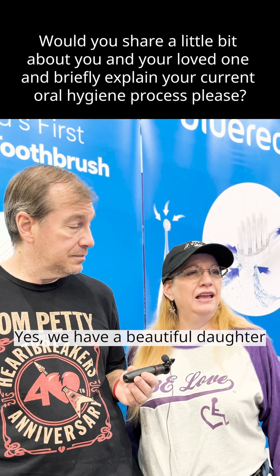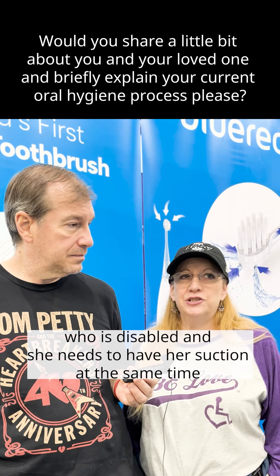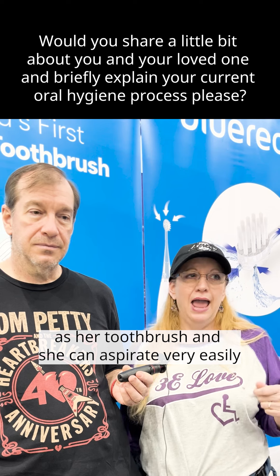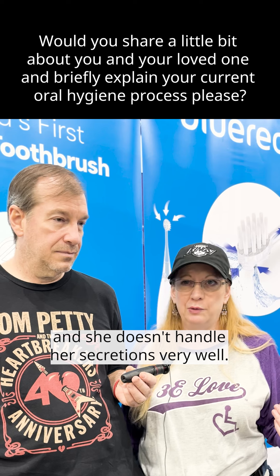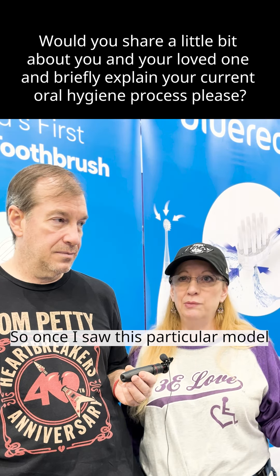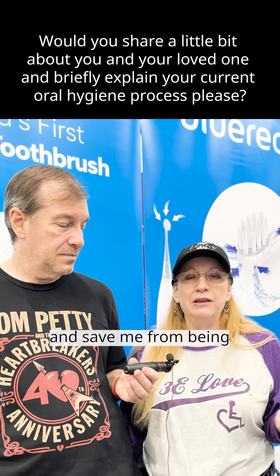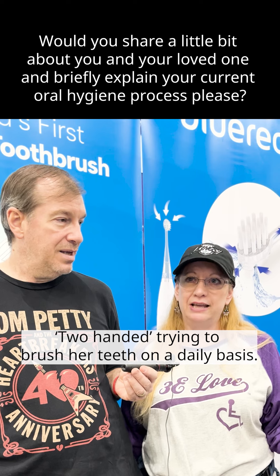Yes, we have a beautiful daughter who is disabled and she needs to have her suction at the same time as her toothbrush. She can aspirate very easily and she doesn't handle her secretions very well. So once I saw this particular model, I fell in love with it and thought this is going to answer all my prayers and save me from being two-handed trying to brush her teeth on a daily basis.